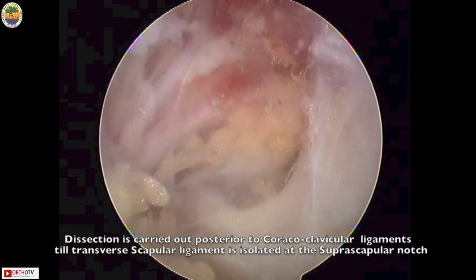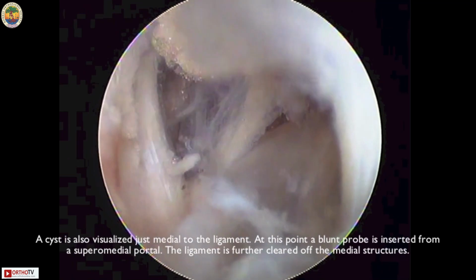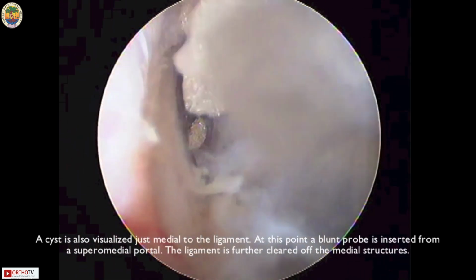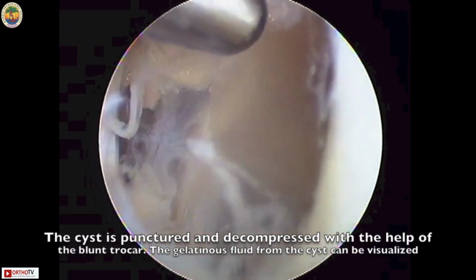Superior-medial portal is then made and a blunt probe is inserted. This probe helps to clear off tissues. A cyst is also noticed just medial to the ligament.